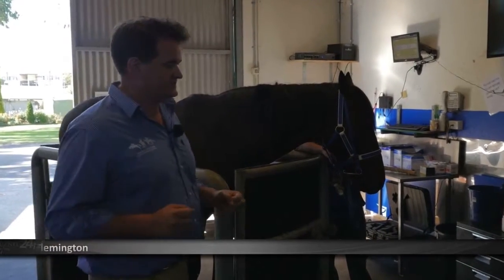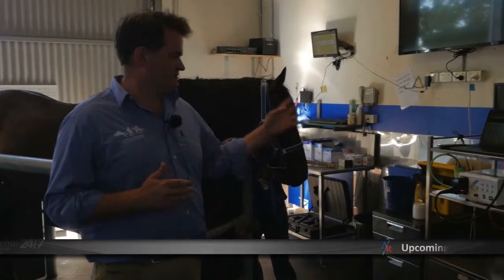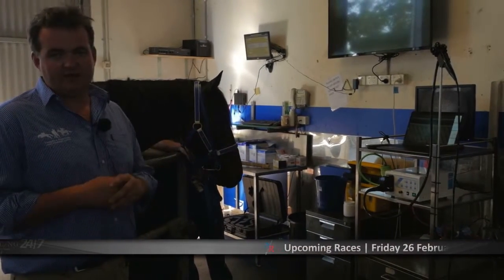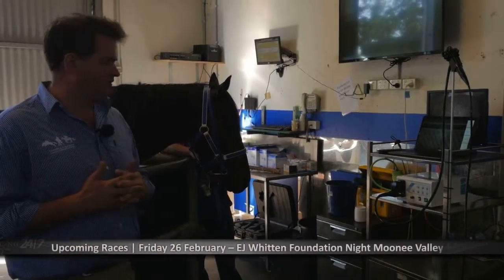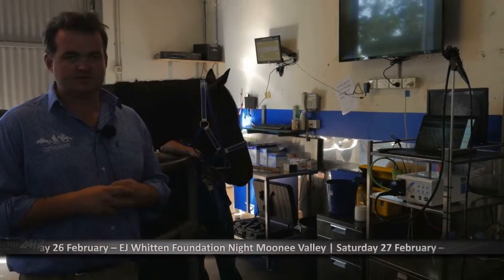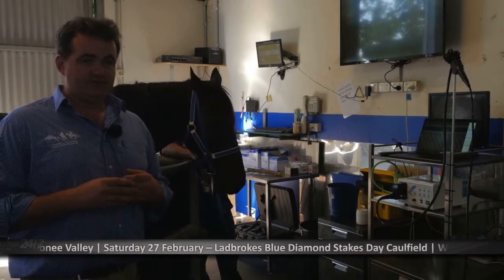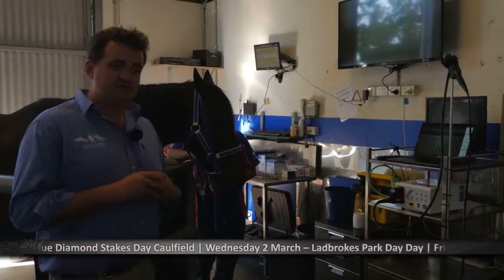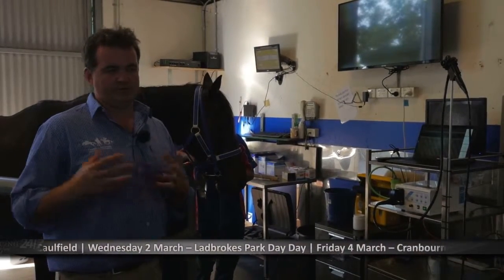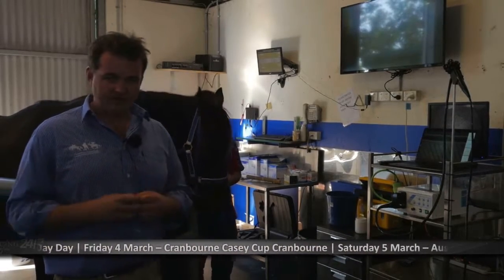Within the room itself, we've got some equipment that stays here full time. In the corner, we've got our endoscope. With our endoscope, we just recently upgraded in the last 6 months, and we record all endoscopic examinations. So horses will routinely be scoped post last gallop before racing to ensure that there's no signs of tracheal mucus, which can be a respiratory infection brewing before it becomes a clinically sick horse. So we try and identify things before they become a problem.